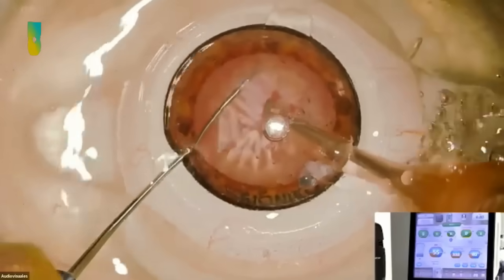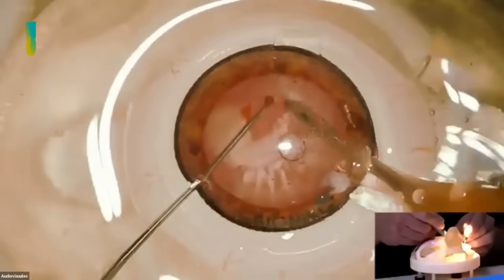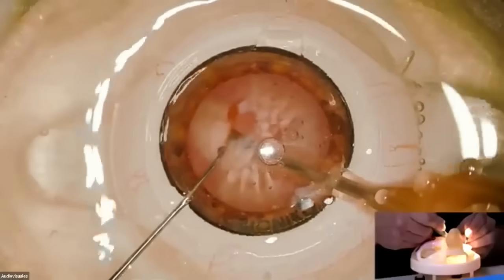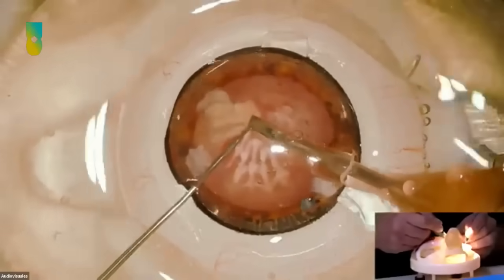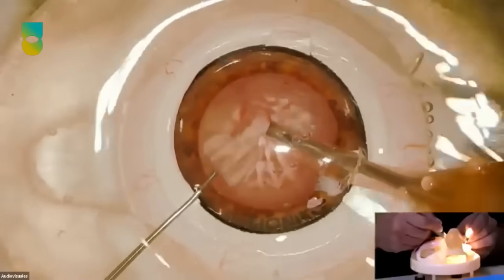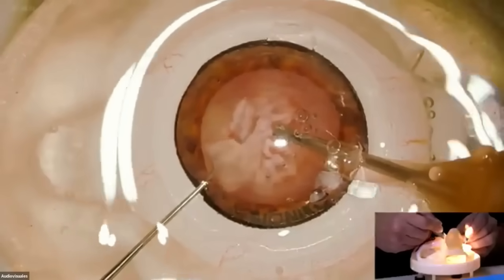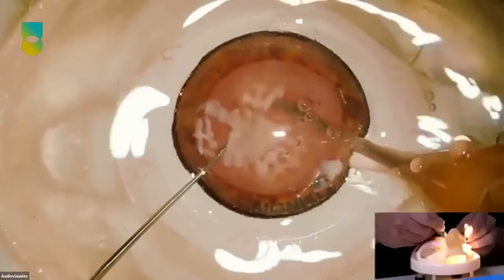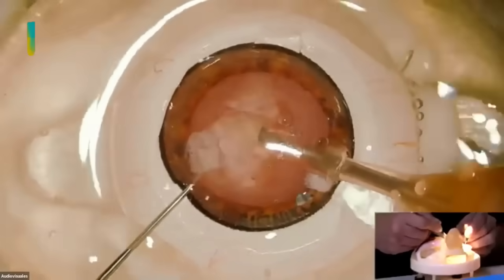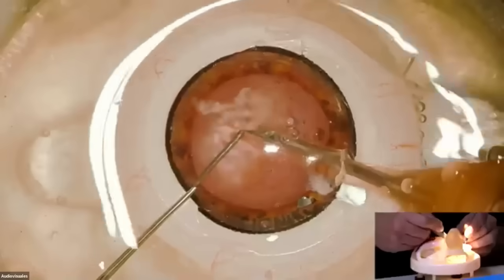Amazing ones. Cecilia, some tips for this step? Pablo is operating, yeah? Pablo, first I will go for the loose fragments. Those loose fragments that are chattering over there are going to disturb you every time. So once you have worked on them, then go deeper. But if you try to go deeper, you see that the loose fragment is over your vision. Yeah, that's it. Very good.